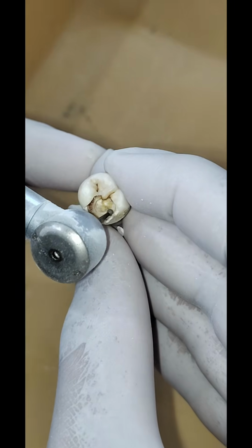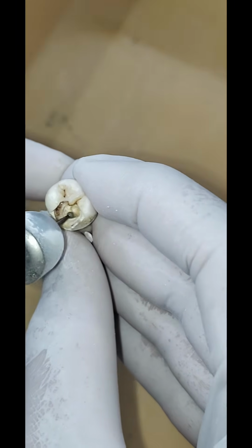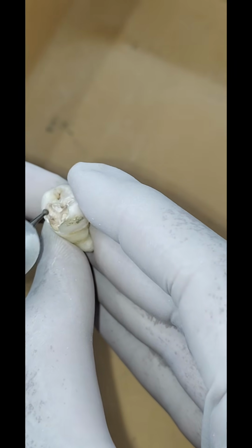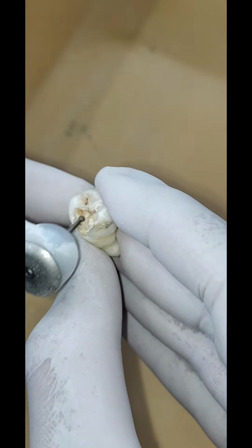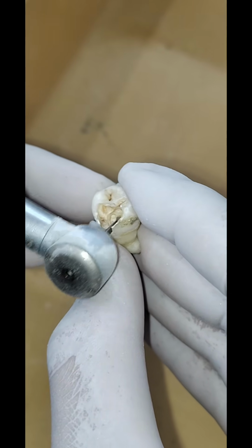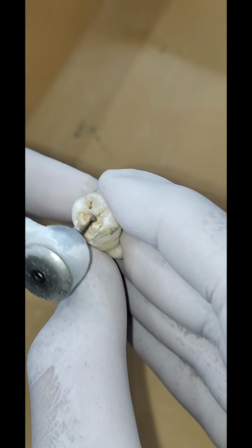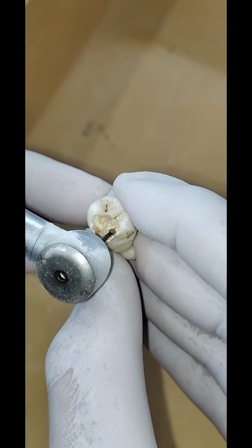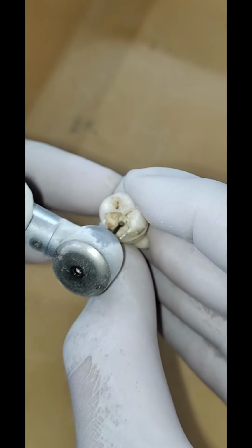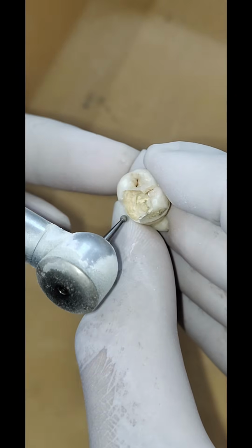So now we're just refining the cavity. We're excavating all the caries, and once all the caries has been excavated, this cavity would be done. So we keep on excavating the caries until all the caries is gone, and after all the caries excavation is done, we start placing the files inside. So I think we're done with the caries excavation.